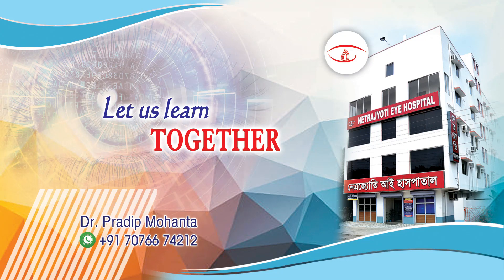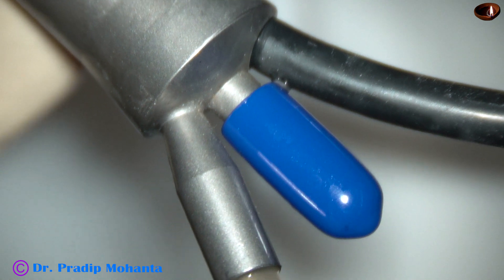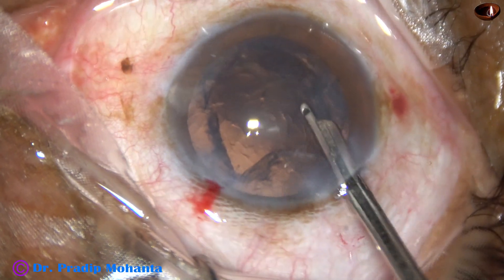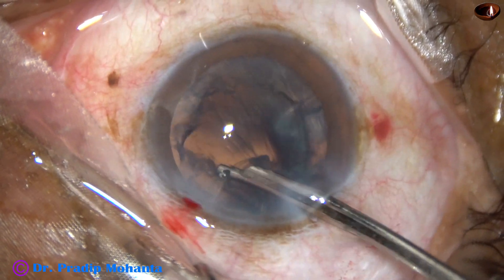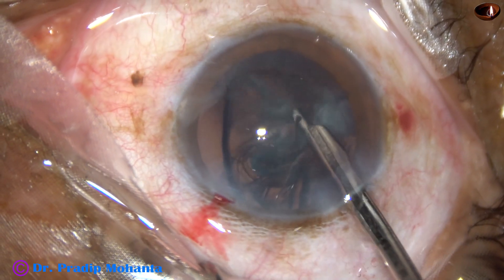Friends, in this video I want to share the hybrid IA of Dr. Ashish Shabkal. The aspirating port is blocked by a cap and the aspirating passage is attached to a separate cannula. Irrigation is by the handpiece and aspiration is by a separate cannula. I have modified the technique a bit.